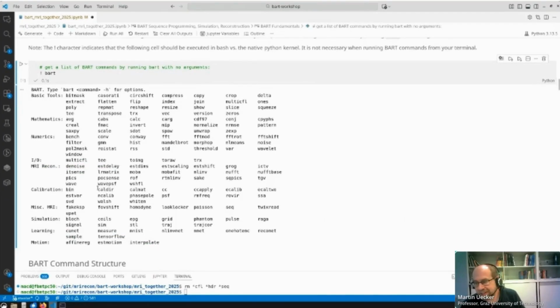I'm not sure if you're following along. Is anybody running and doing that at the same time with us? Still running that? I don't know. Maybe you could give us a hint in the chat if you need to wait a little bit longer. I ran it. Okay. Yes, still running. Okay. I'll talk a bit about what BART is, and then you can catch up before the real content starts.